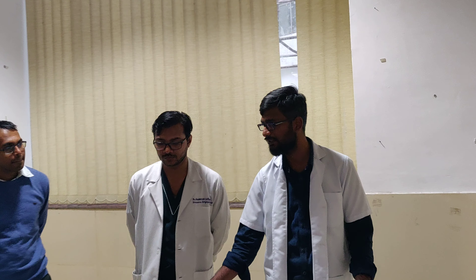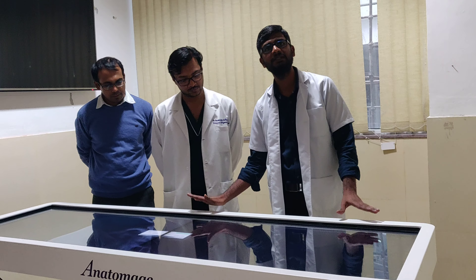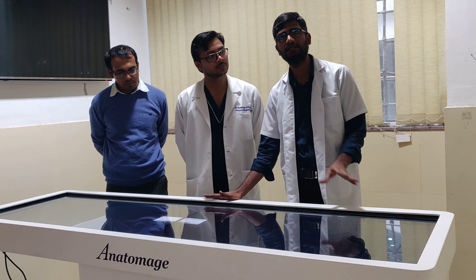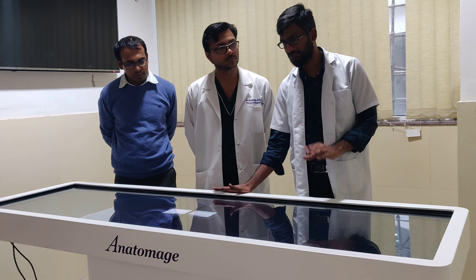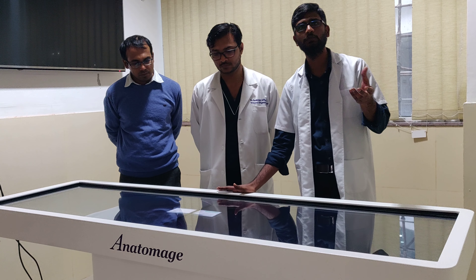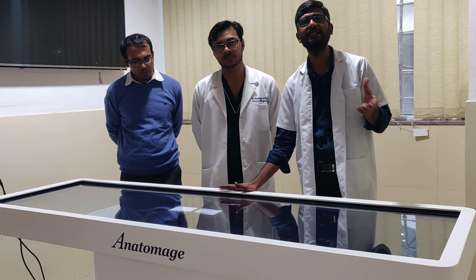Good evening sir. This Anatomage table we use for teaching purpose as well as clinical purpose. Mostly we are using for clinical purpose. For clinical purpose, we use it to do normal CT and MRI.